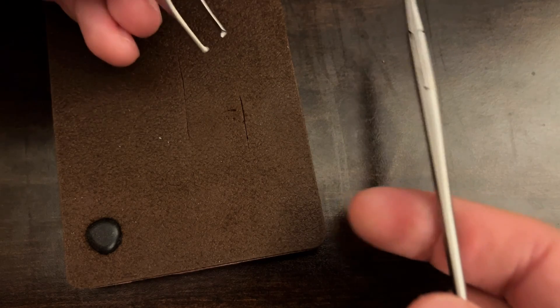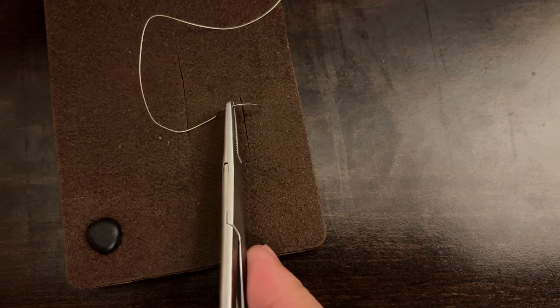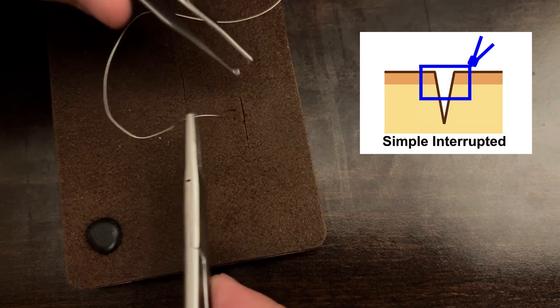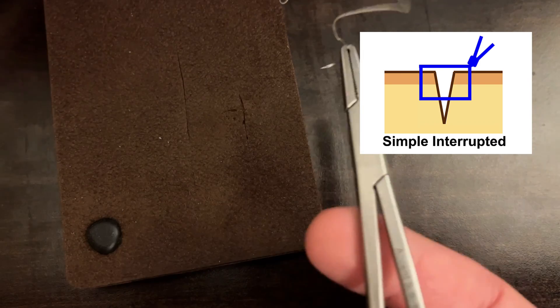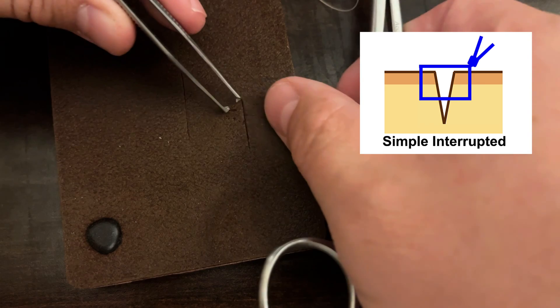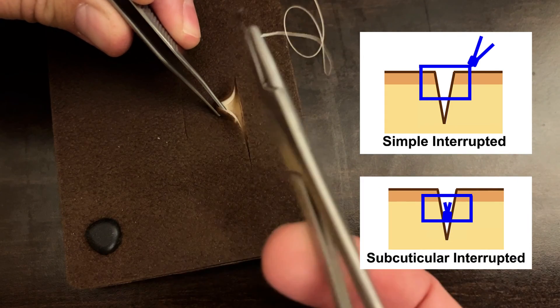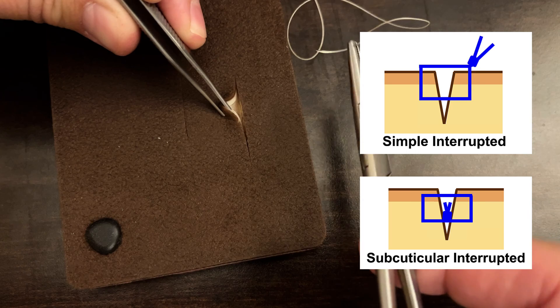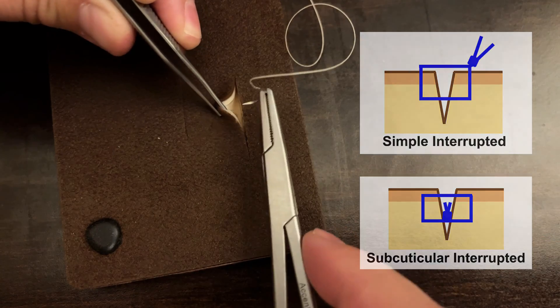The idea with this interrupted subcuticular suturing is that it is very similar to our simple interrupted skin-level closure except we're going to do it upside down. With a simple interrupted we start superficially and go deep. With subcuticular interrupted suturing we're going to do the exact opposite — we're going to start deep and go superficial, and then on the other side go superficial to deep. That way when you tie your knot, the knot will be deep. This is basically a simple interrupted suture except inverted and buried.